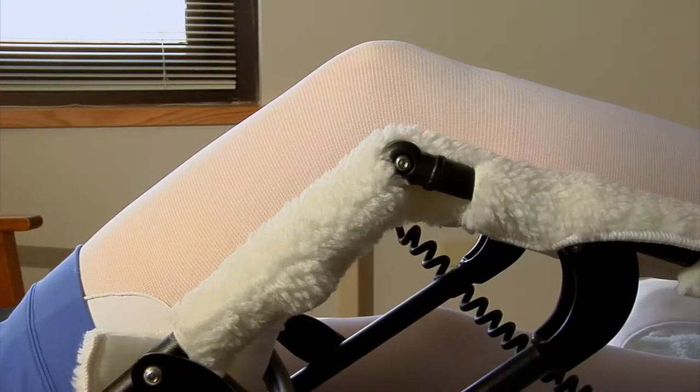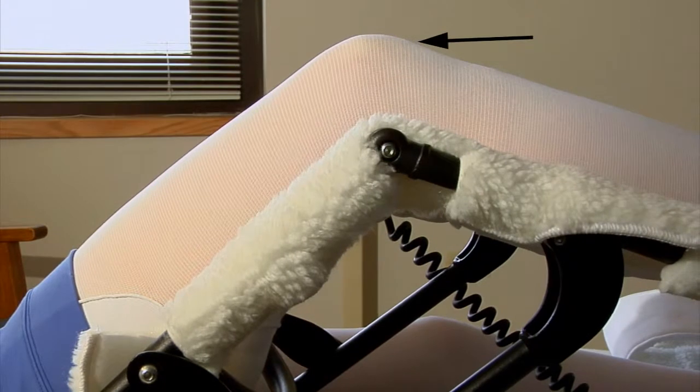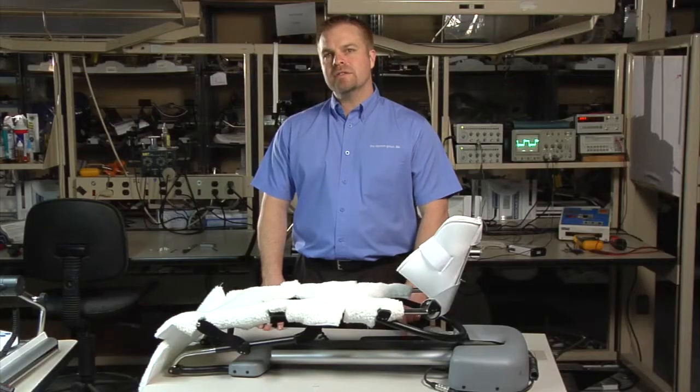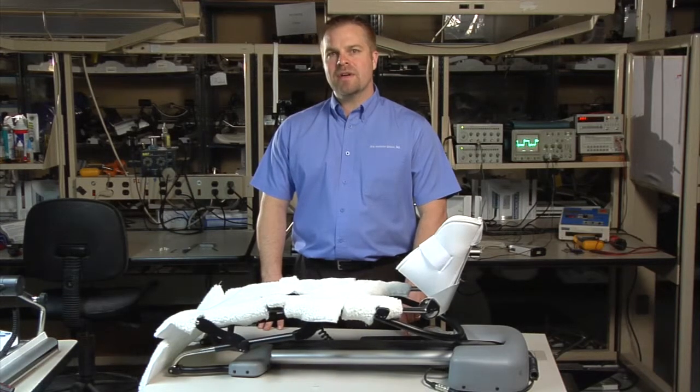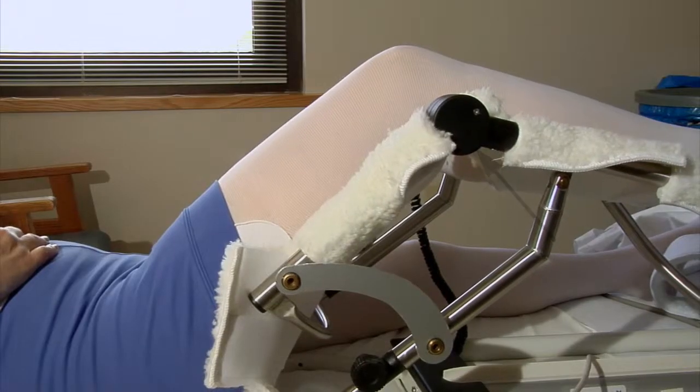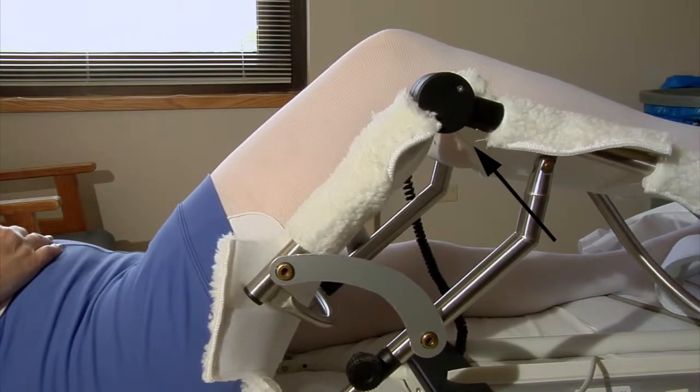Once the pad kit is properly installed, the most important part of fitting the CPM to the patient's leg is to make sure the knee bends in the same place as the CPM machine. On occasion, some patients may have an extra heavy dressing following their procedure. When this occurs, you may need to feel for the knee bend by placing your hand in the popliteal fossa region of the patient's leg, or the back of the patient's knee. Although it is ideal to have the knee hinge aligned exactly with the CPM hinge, it is acceptable to locate the knee an inch on either side of the hinge on the CPM.